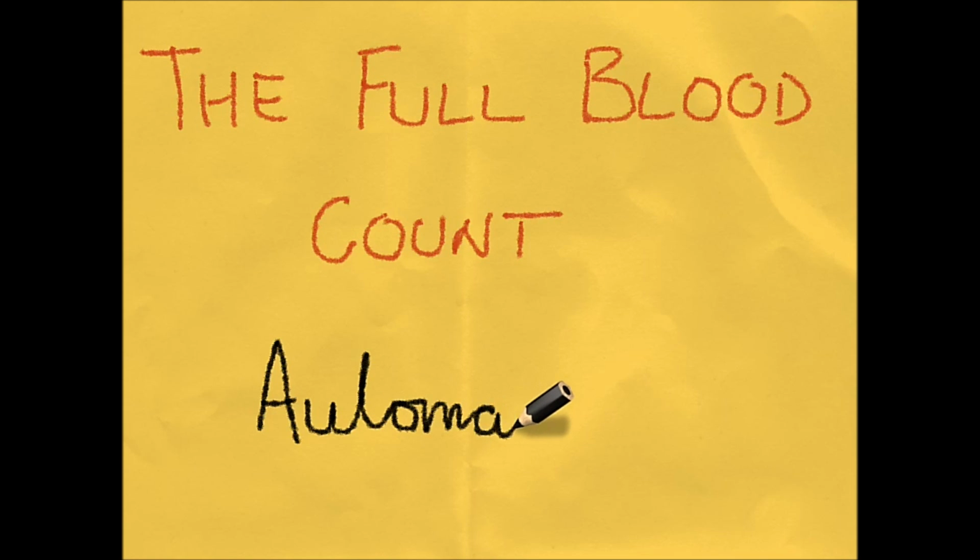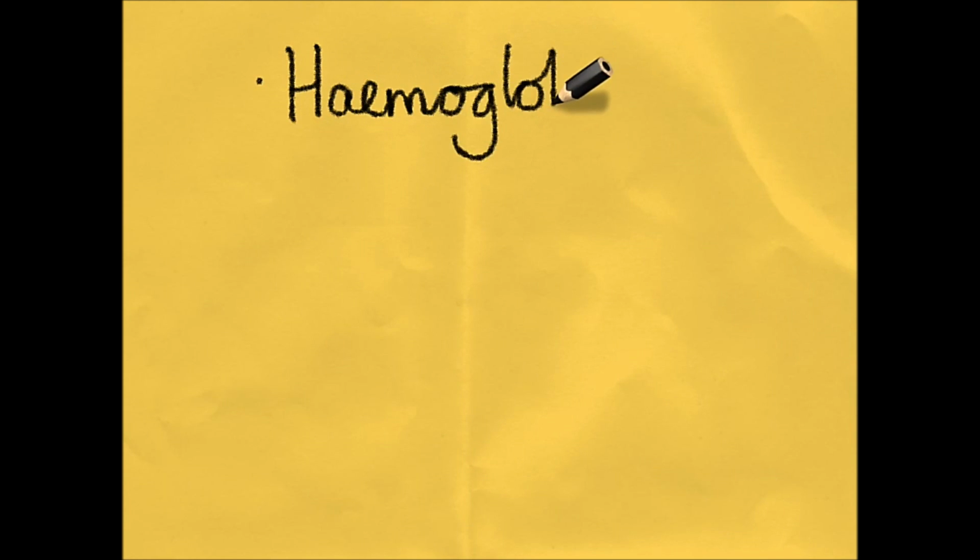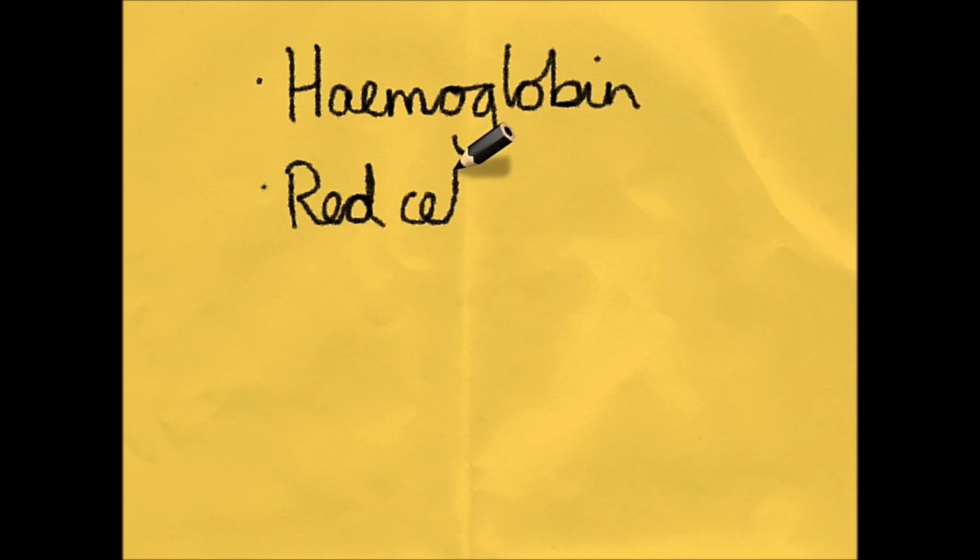I mentioned that we do more than 800,000 full blood counts per year in UHL, and so this has to be a largely automated process. So, what do we get out of a full blood count? What is a full blood count?